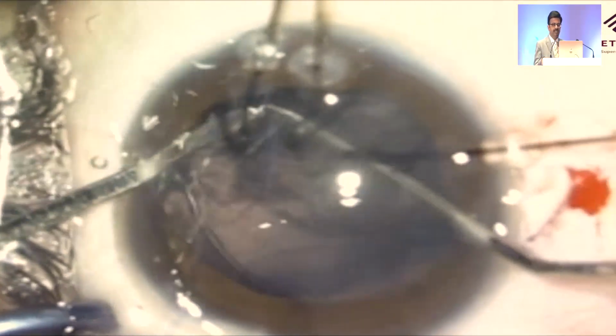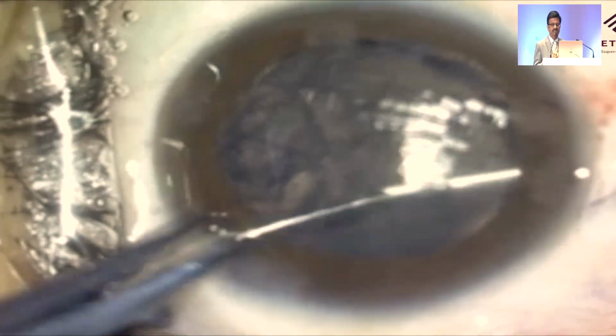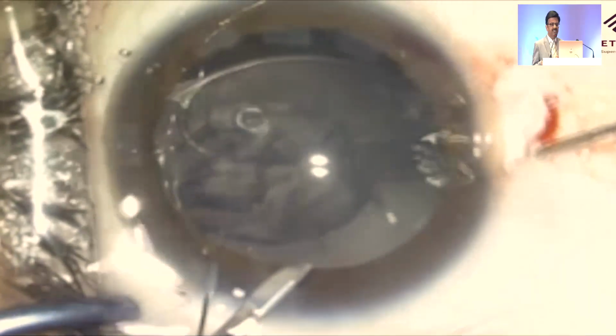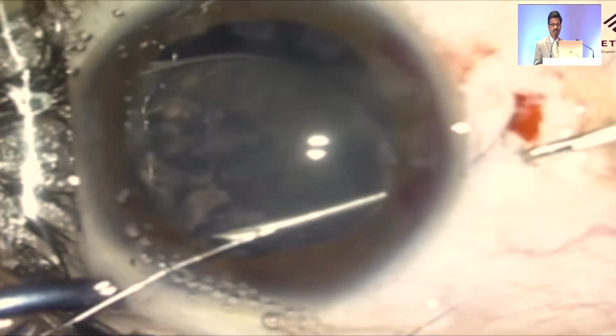In one of my cases, due to the small size of the bag, the ring came out into the sulcus again, and once it is in the anterior chamber, it becomes very difficult to reinsert. As we did in the previous case, it is sutured to the sclera, and the lens is well centered. Most of these cases are older children, so we try to avoid a posterior capsulorhexis, and if needed, do an early YAG in the post-operative period as soon as you see indications of posterior capsular opacity.